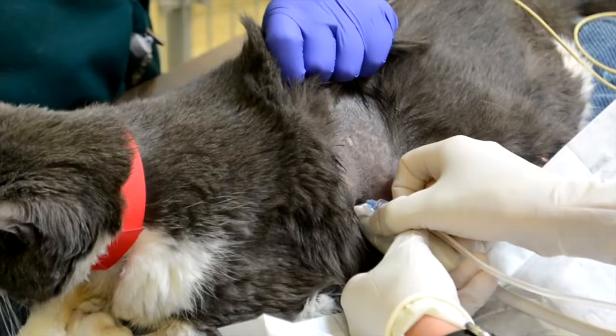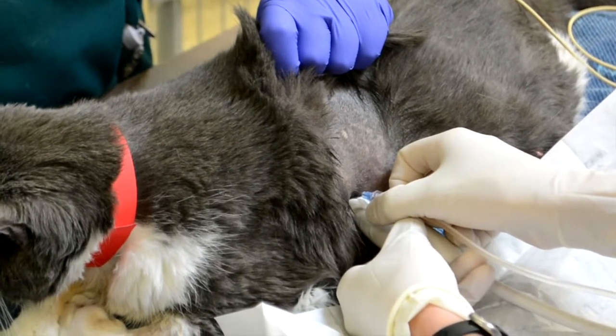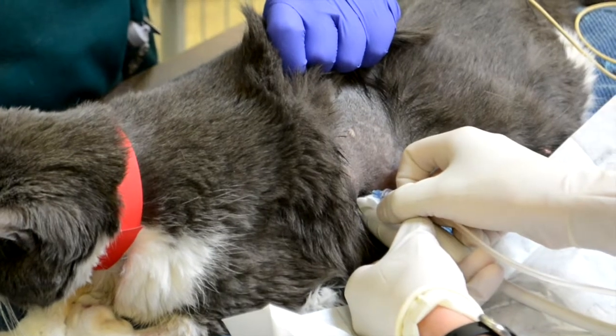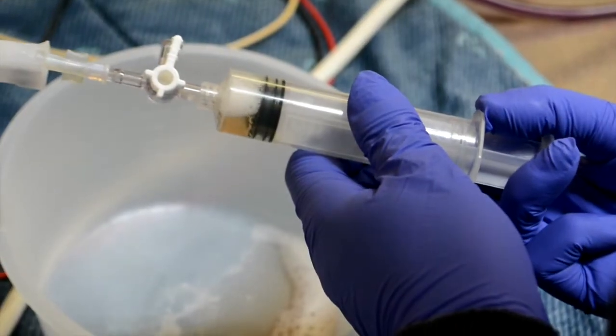I'm going to take my needle and insert it perpendicular to the chest wall. Even if you hit lung, the lung's going to seal — it's going to be okay. If you hit the heart, you'll feel it and you'll back out — it's going to be okay. Once you insert your needle directly in, you're going to aspirate back, or if it's easier, have somebody else handle the syringe while you handle the needle.